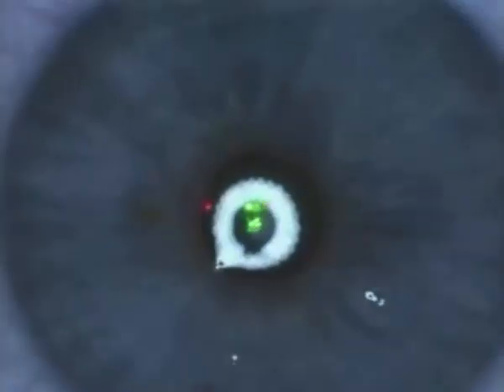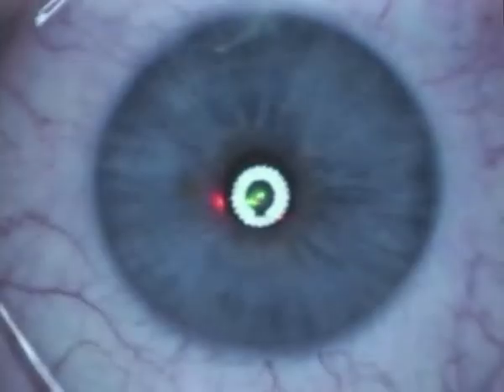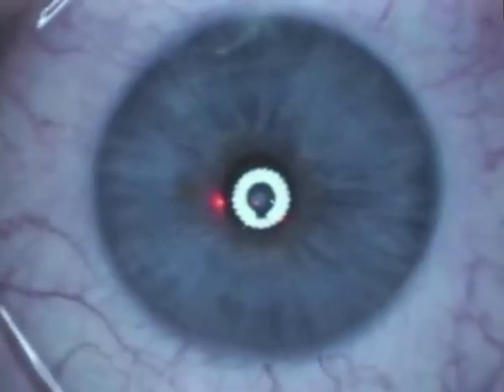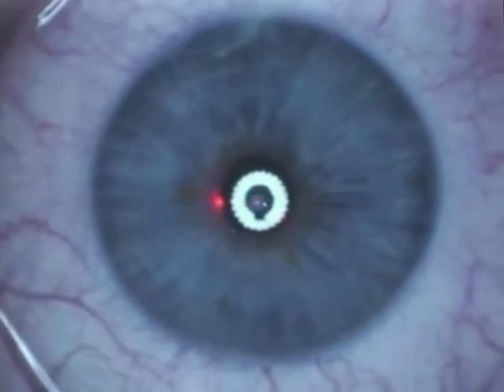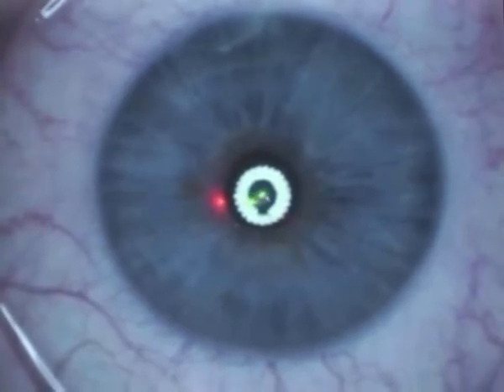Anesthetic is instilled. Prophylactic antibiotics — ofloxacin, tobramycin, and dexamethasone — are applied. We then place the bandage contact lens in the eye. My preferred lens is the Oasis 8.8, either plus a half or minus a half contact lens.